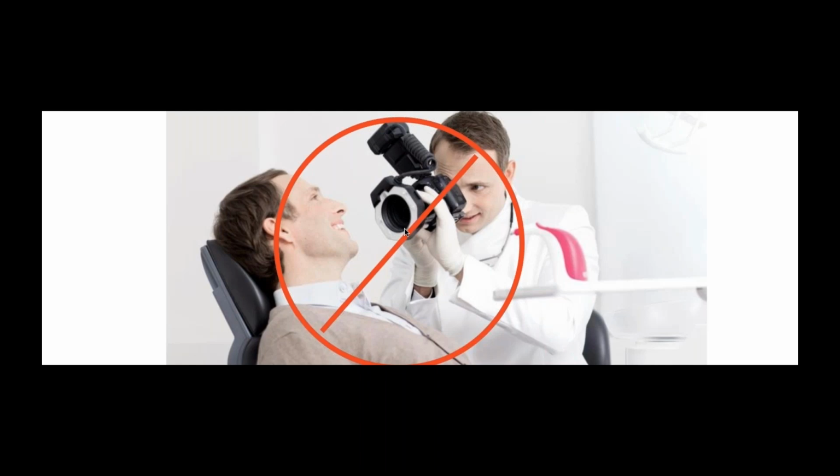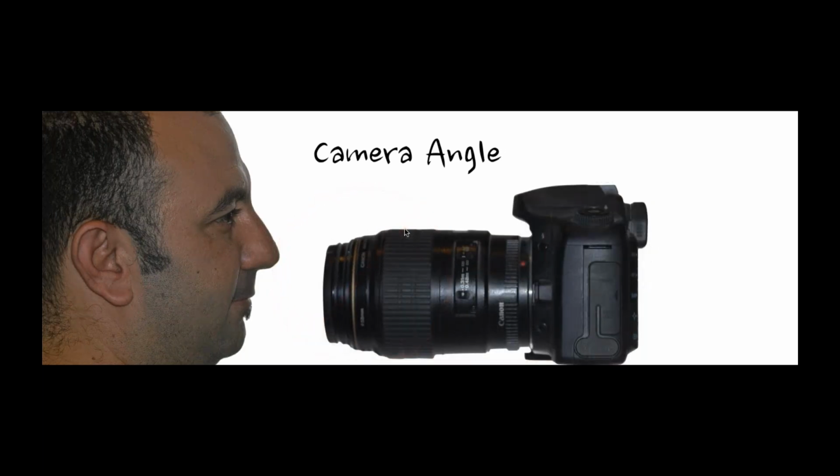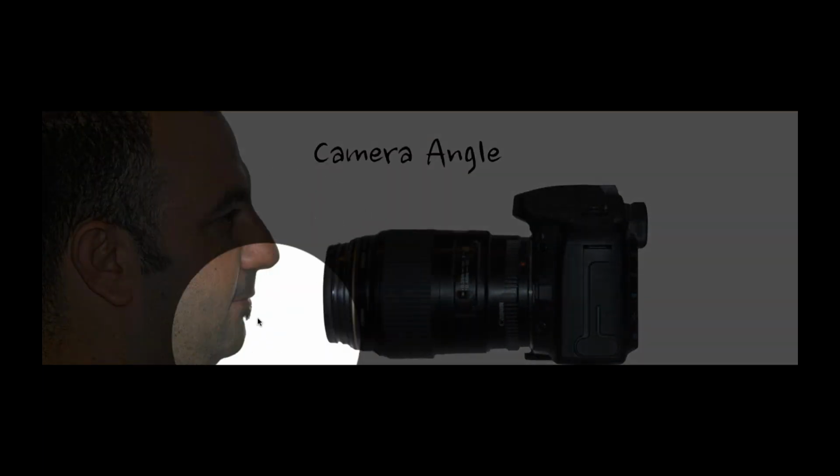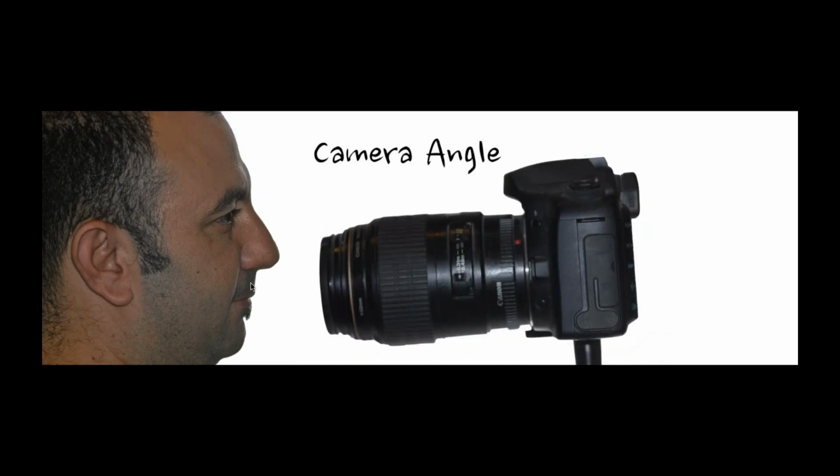I want them sitting or standing against a wall so they're braced and stable. And I want to make sure you're above the patient because I don't want the camera angle to be shooting up at the patient. I want that camera angle to be a little bit more horizontal to the flat of the lip or the flat of the tooth, or even better, maybe a little higher up where I'm getting a better angle into the angulation of the teeth, whatever that may be.